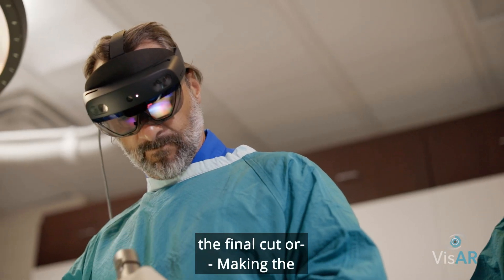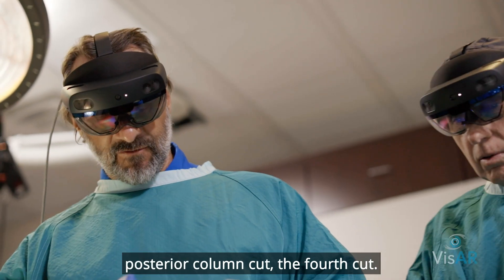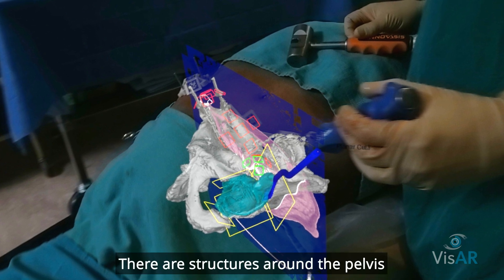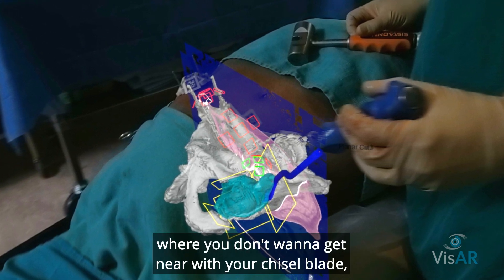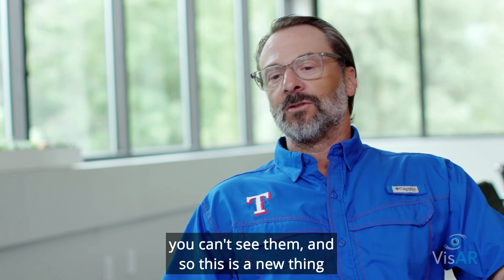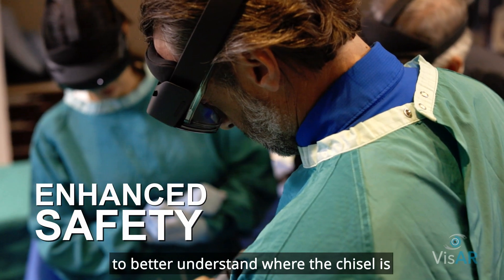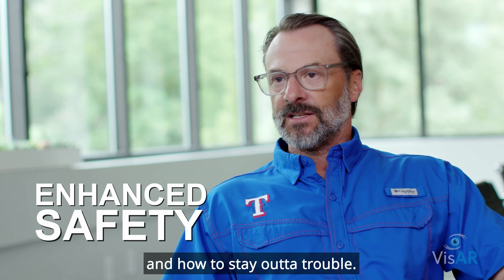Now making the posterior column cut — the fourth cut. There are structures around the pelvis where you don't want to get near with your chisel blade, and you can't see them. So this is a new thing that we can lean on to better understand where the chisel is and how to stay out of trouble.